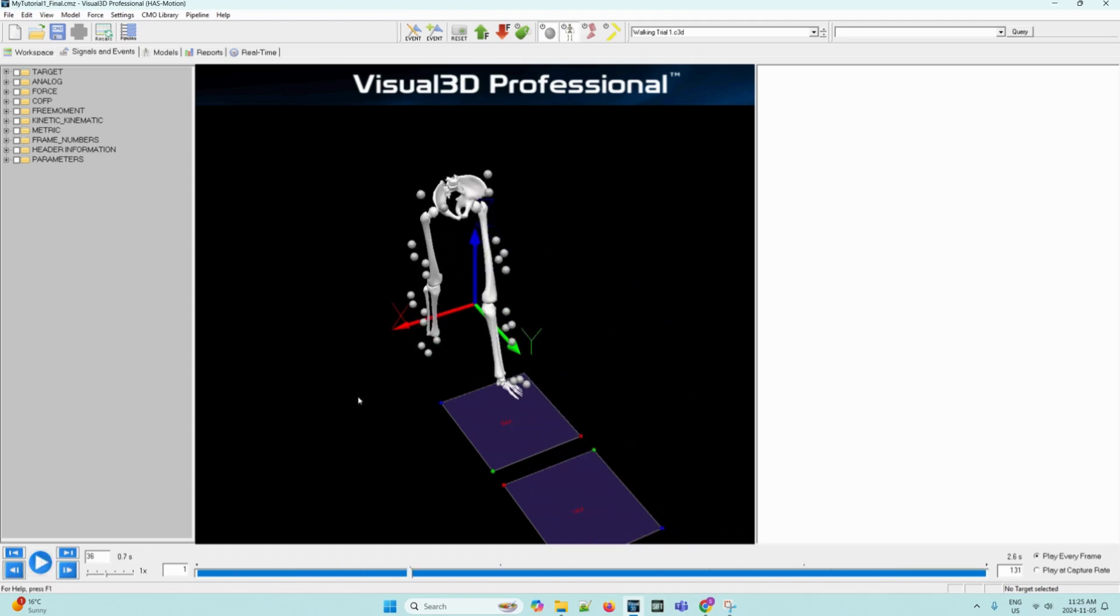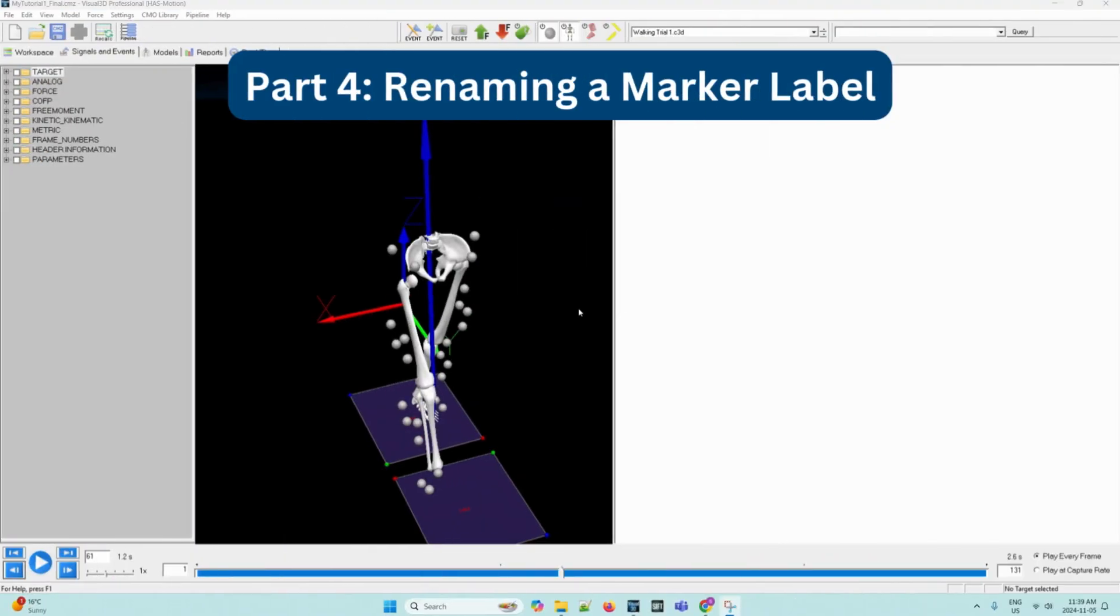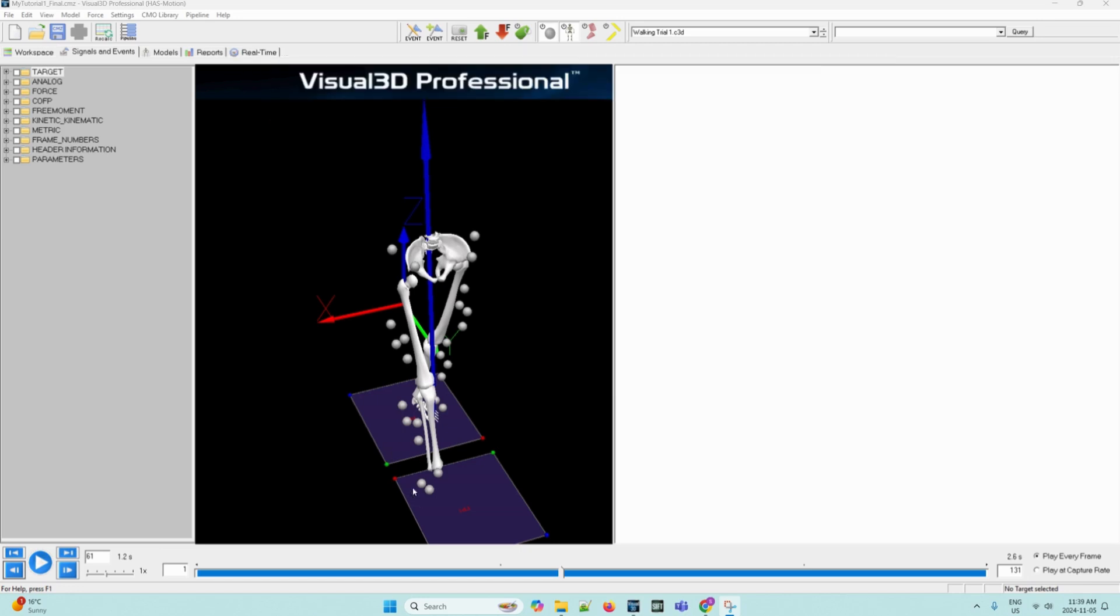Just a note, if you see one of the feet missing on the model, don't be concerned. This error was purposely introduced in the marker labels to fix it in the next section. Simple marker labeling errors may become apparent at this stage. For example, the missing right foot segment in the previous section. The RFT1 marker was accidentally labeled RFT1A when the marker was identified in the data collection program. These types of errors can easily be corrected in Visual 3D.